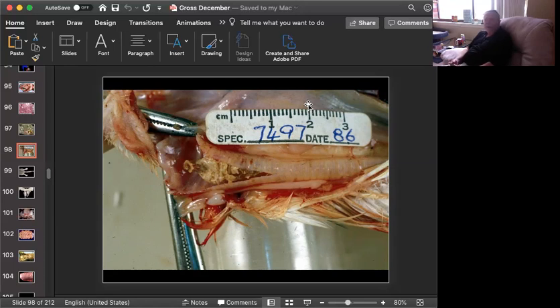If you look at the sloughed plug histologically, that is where you often will see multinucleated cells and cells with intranuclear inclusions. And sometimes you'll see multinucleated viral syncytia with multiple nuclei containing these viral inclusions.